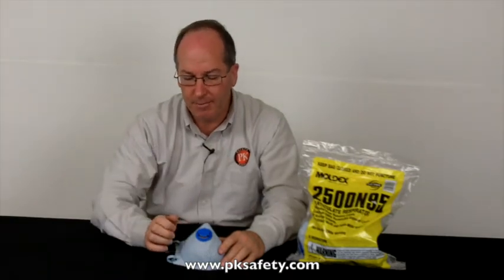What this charcoal layer does is it absorbs acid gases. Things like chlorine bleach — around the house, working on the tubs, something like that — this is going to absorb that, take that smell out. These are nuisance organic vapors and acid gases, though, very important distinction. It's not like wearing a cartridge respirator.